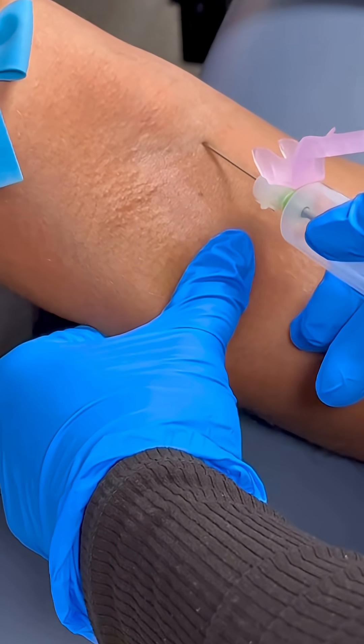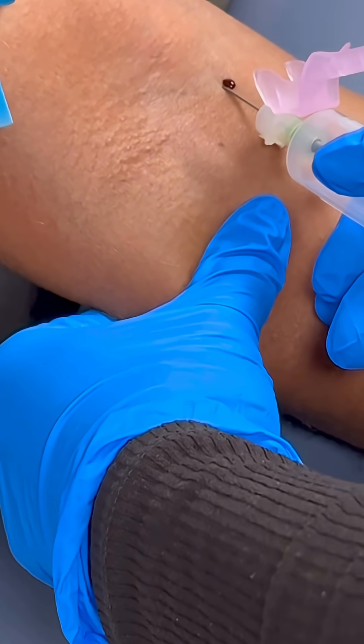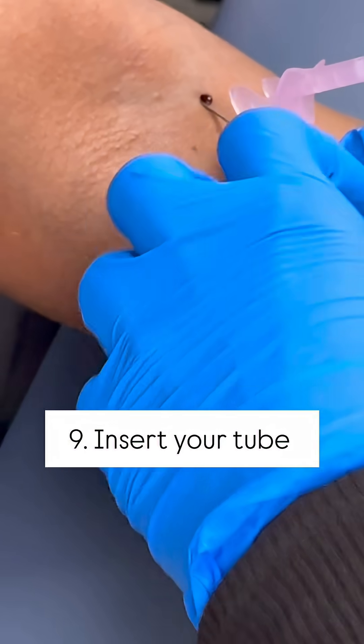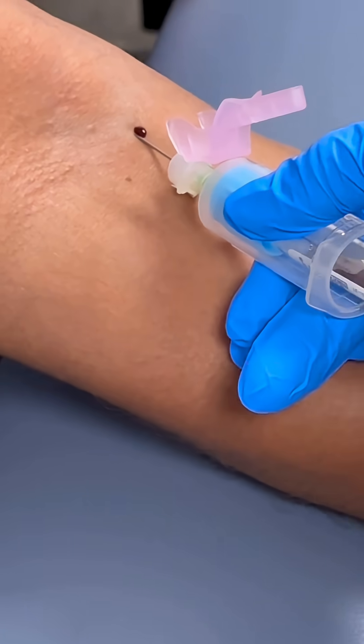I'm going to anchor the skin down, hover over the site — this is exactly where I want to go — and I'm going to go in. You see a little splash of blood; that's a good sign. You know you're at least in the vein.